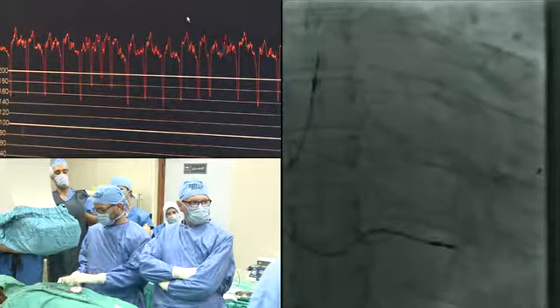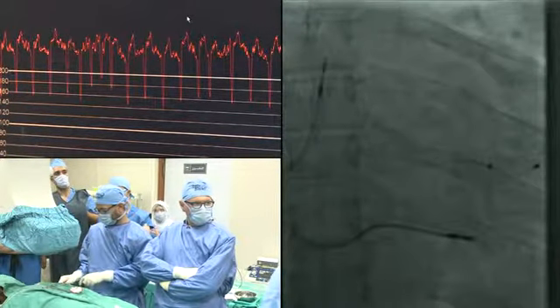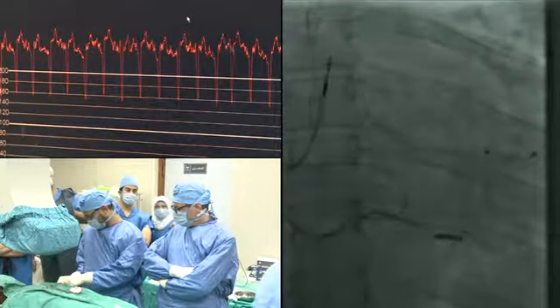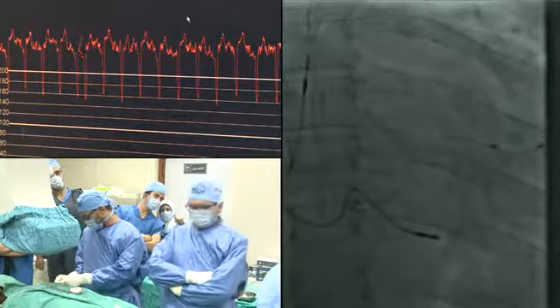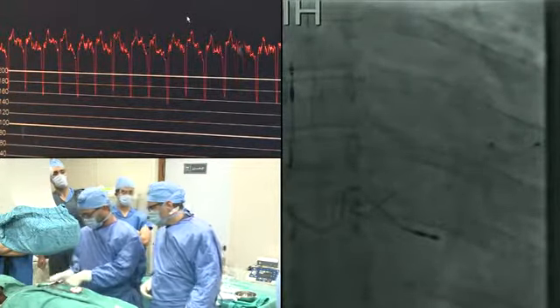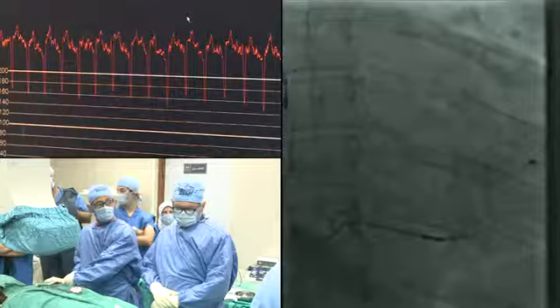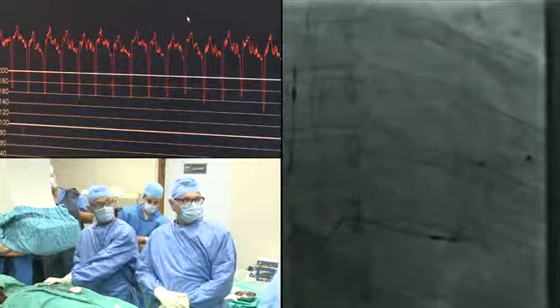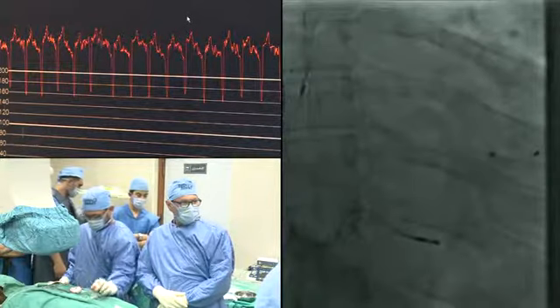The introducing system is now out. This is not too good. I will continue the slitting after being sure it is out. There's quite a bit of slack in that CS lead too, isn't there? I will get the system out fully before continuing slitting because the slitter slipped.